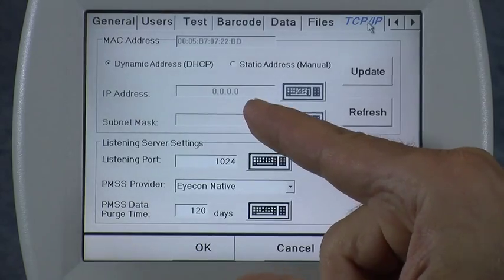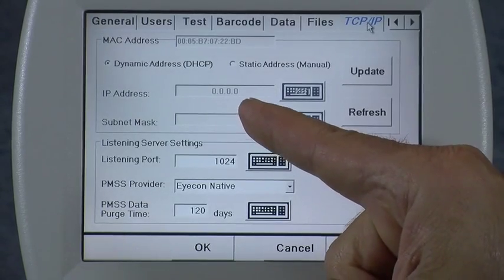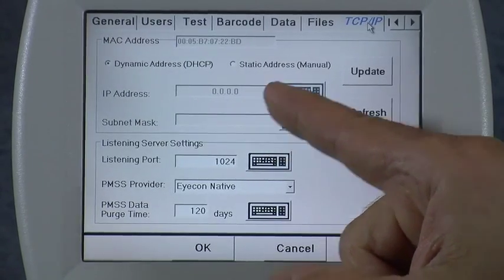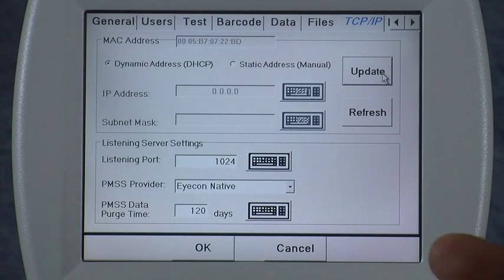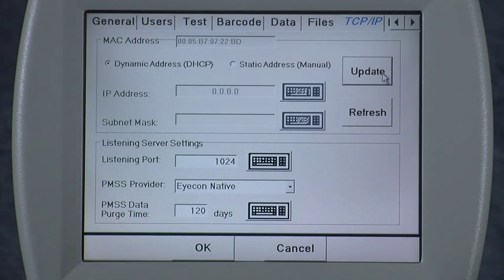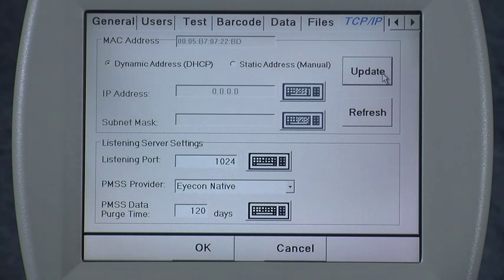Right now you can see that the IP address is zero. If I hit Update it stays zero. I do not have a network connection right now, so if you don't have a connection that's a good indication there's a problem — either your connection to your router, the power-up of your router, or just check all your cable connections.